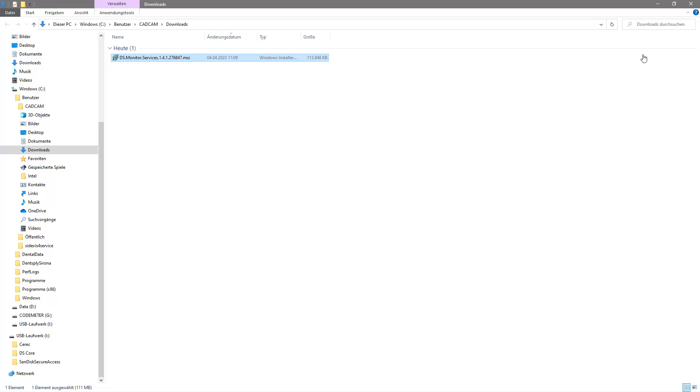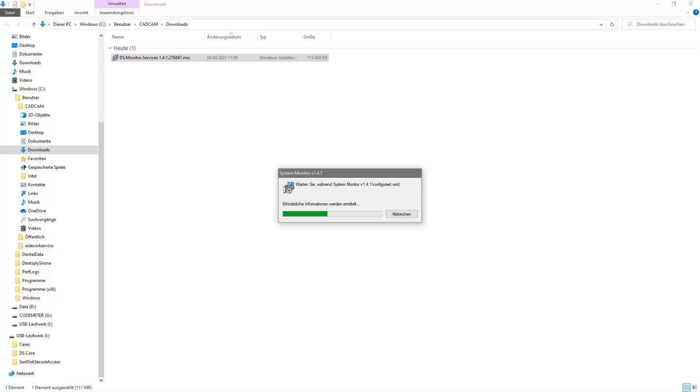With a double-click, we start the installation. The green bar displays the status of the installation.